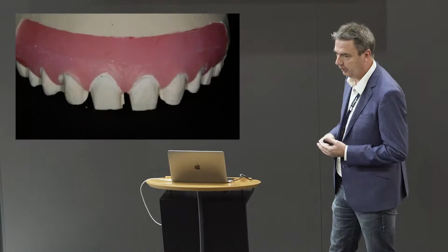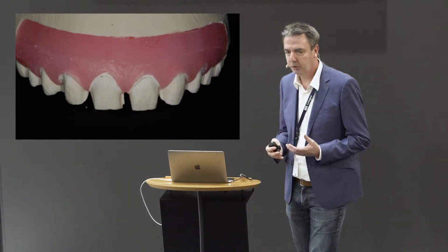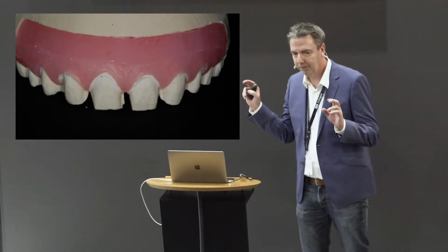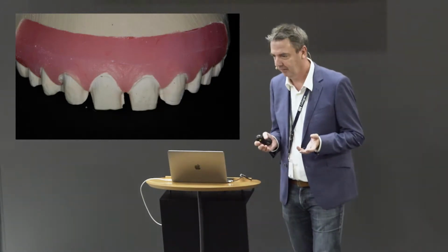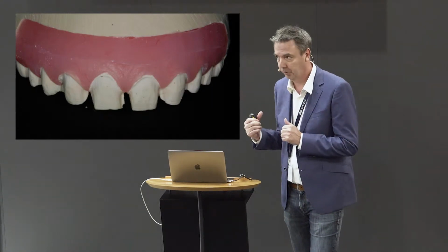And the next picture shows the preparation I've done in 2003. And to be honest, in 2003, I called this minimal invasive dentistry. From today's perspective, this is a nightmare. This is really an aggressive preparation. I mean, it's 0.8 millimeters. It's not 1.5, but nevertheless, it's far too aggressive.